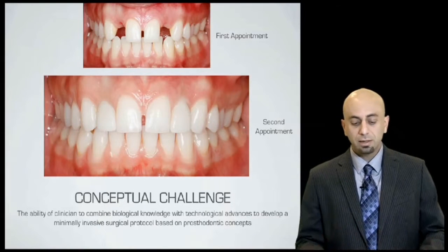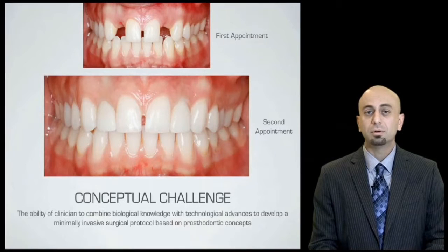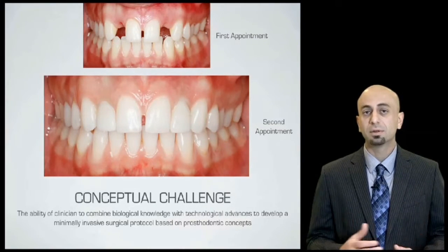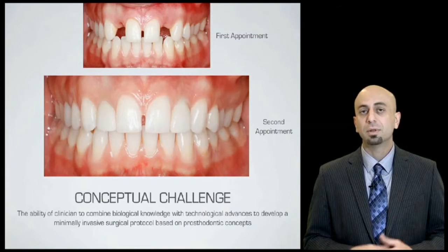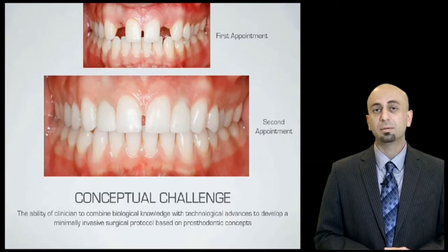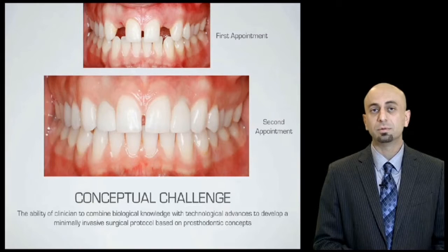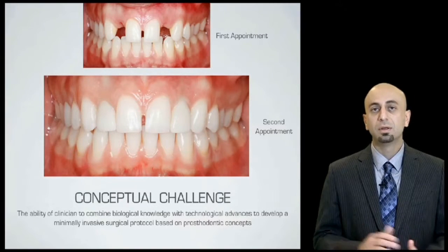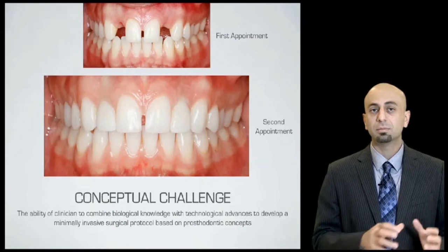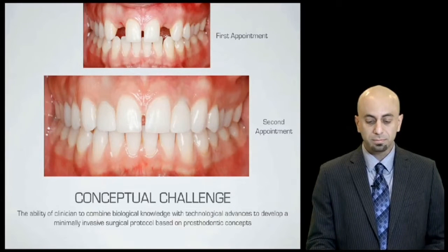So the conceptual challenge is the clinician's ability to combine their clinical knowledge in achieving such a task. And I'll get to that in just a little bit, but just to touch on it, obviously we need to know the implant placement, implant angulation, mesiodistal distance between the implant and the natural teeth, and so on and so forth. We also need an understanding of some computer technology to be able to achieve this.